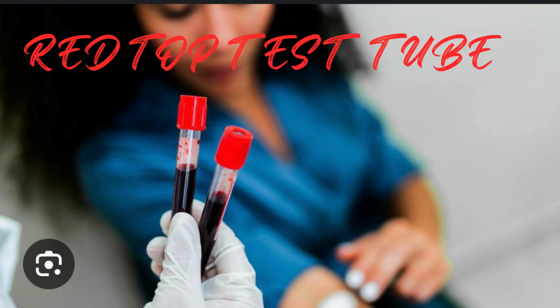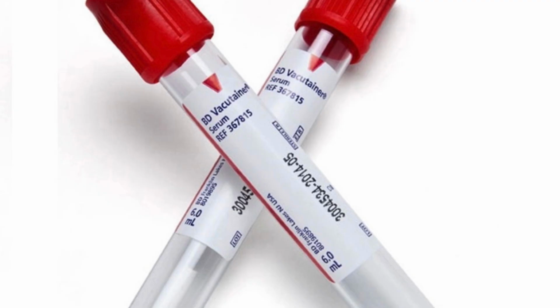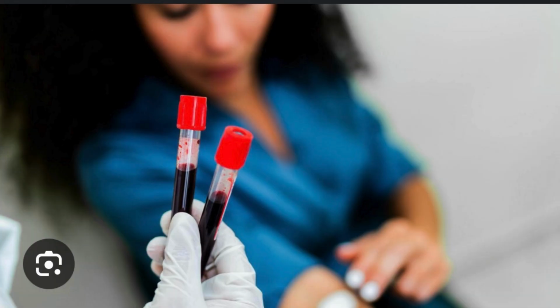The red top tube is used for various types of testing, such as serum testing, hormone testing, and the list goes on. The red top tube does not contain any additive. Why? Because no additive allows the blood to clot naturally. Red top tubes are often used for tests that need to be done quickly. We don't invert red top tubes. And this is it for the red top tube.